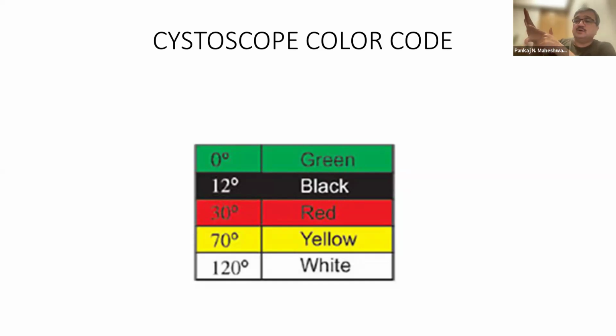Same way, if we look at a 30° telescope, then in narrow angle it will be 45 and 15, so the field will be bent downwards by 30 degrees. And it remains 120 degrees in wide angle. So the field of vision, I believe, is 90 and 120, but please reconfirm this.